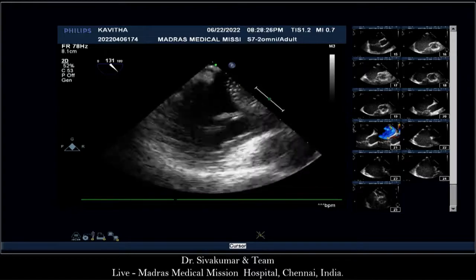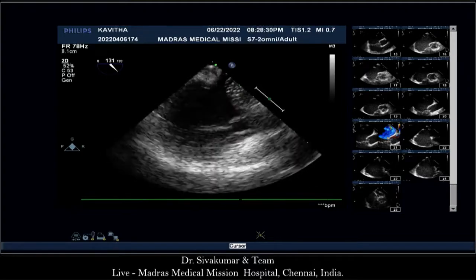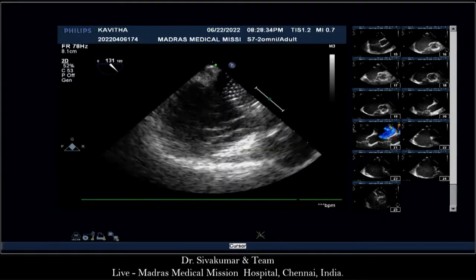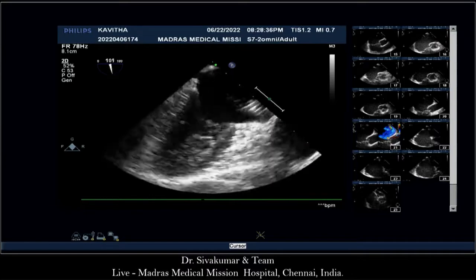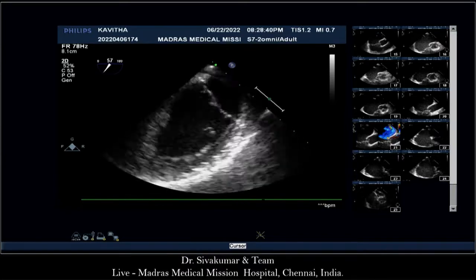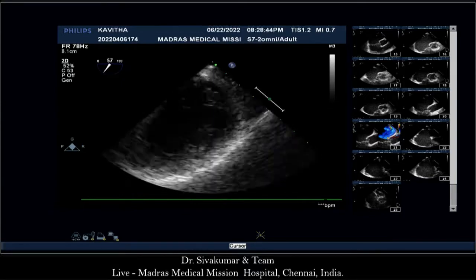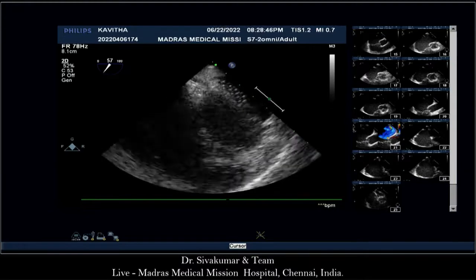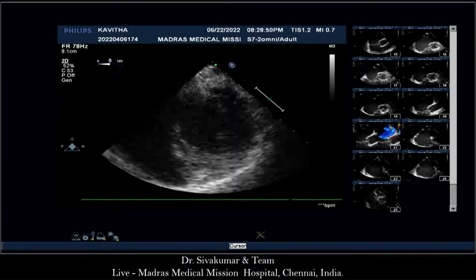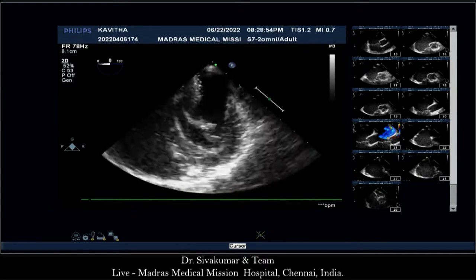But what I would like to show is that the device is not being touched by the mitral leaflet. Shiva, can you show us in 4-chamber view or go to 180 now? Go to 180, like you reverse, yeah. This is the mitral valve, LA to LV. The moment I get it in the middle, the picture becomes a little suboptimal. You see here now? Okay, I'll make it.